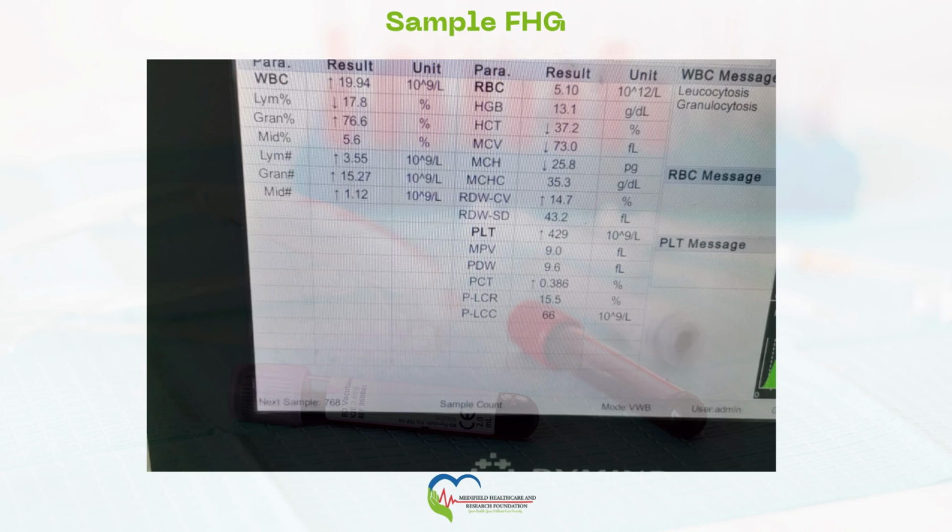Again, we do not have the monocytes in this picture. That is really not helpful for us now, but at least you have the picture that there is an infective process. There is leukocytosis marked with granulocytosis, query neutrophilia, query eosinophilia, query basophilia, and then manage that patient appropriately. This at least will guide the further diagnostic tests that you can order on this patient.